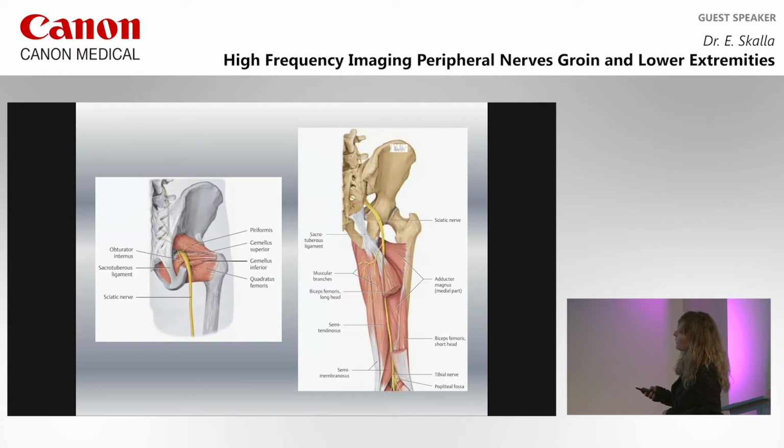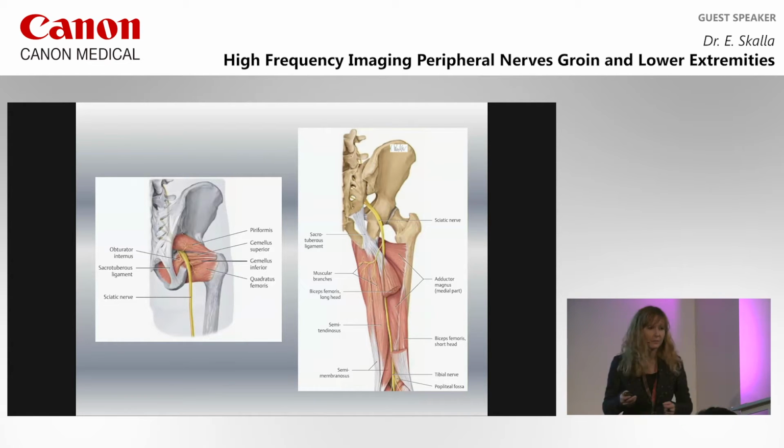And an important muscle for sonography is the quadratus femoris muscle. It continues through the dorsal part of the flexor muscles, under the hamstrings, straight downwards to the popliteal fossa.